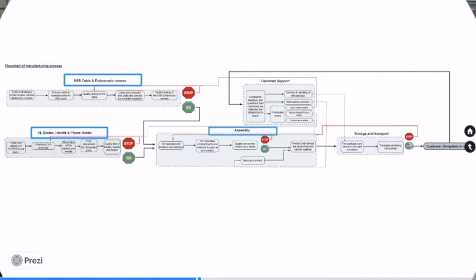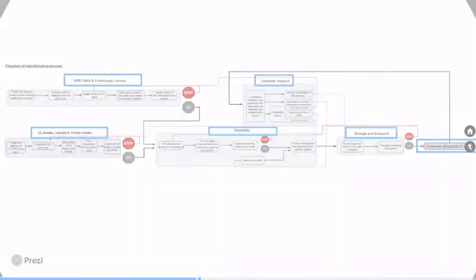Next is the assembly, which consists of gluing in the lens and packaging all the individual components of the laryngoscope. Again, batch tests are conducted to ensure the quality of the final product. Following the packaging, the laryngoscope is shipped to the customers in the low to medium income countries. After this, the communication between us and the client is not over. Should the customer encounter any problems, the source of the problem will be identified and the appropriate steps taken to eliminate the problem, as shown by the feedback loops in the chart.